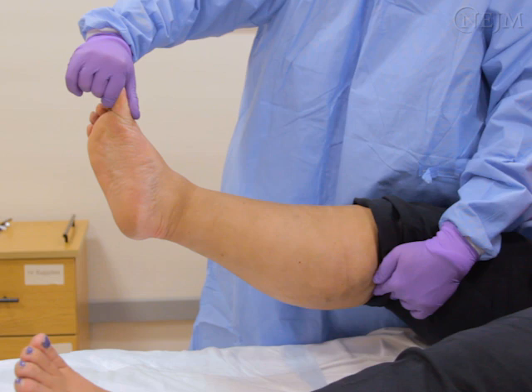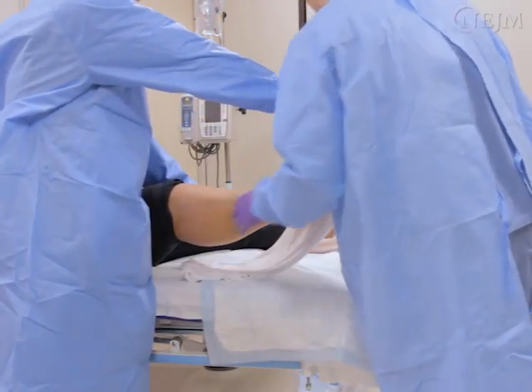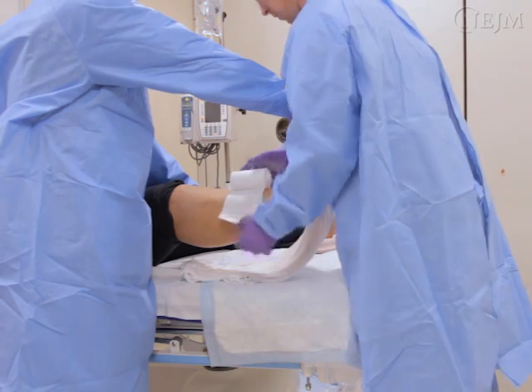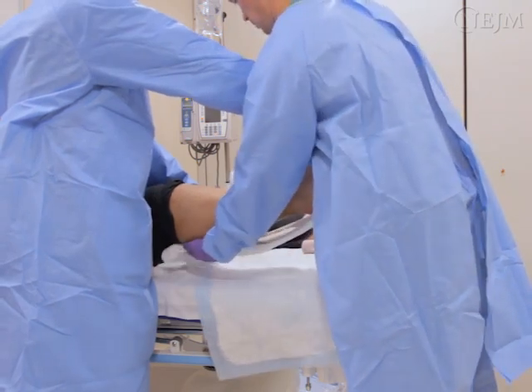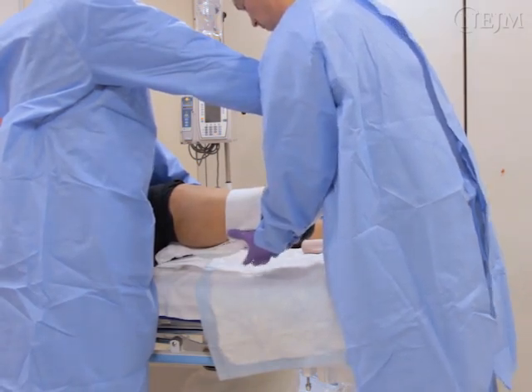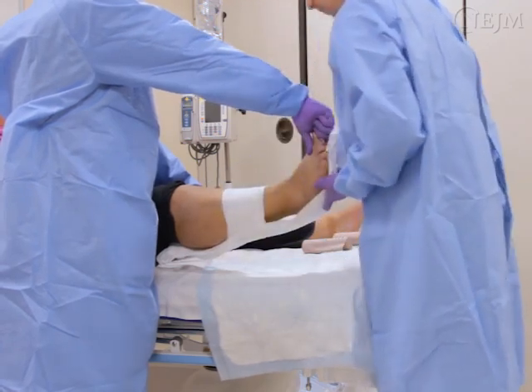Once you have reduced the ankle fracture, dip the splinting material in room temperature water and apply the posterior slab of the splint. It should extend from just beneath the popliteal fossa to approximately 3 centimeters beyond the big toe. Wrap the slab with a single layer of cotton padding material to maintain its position.